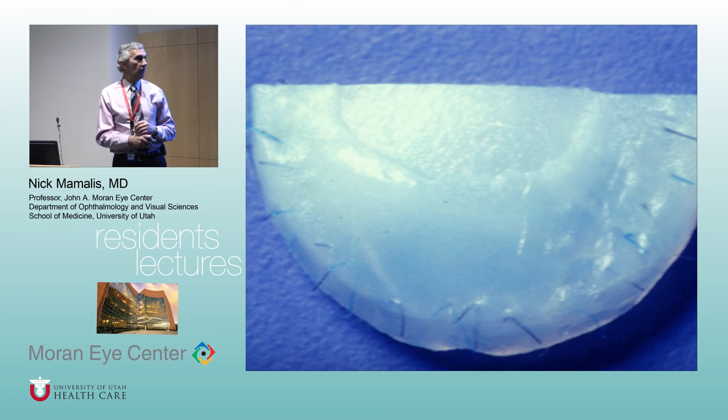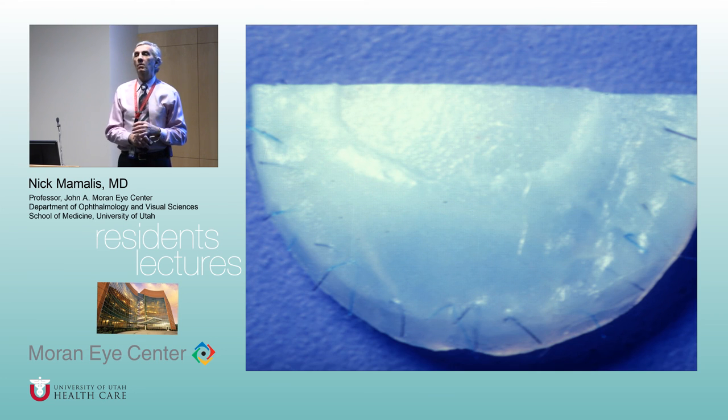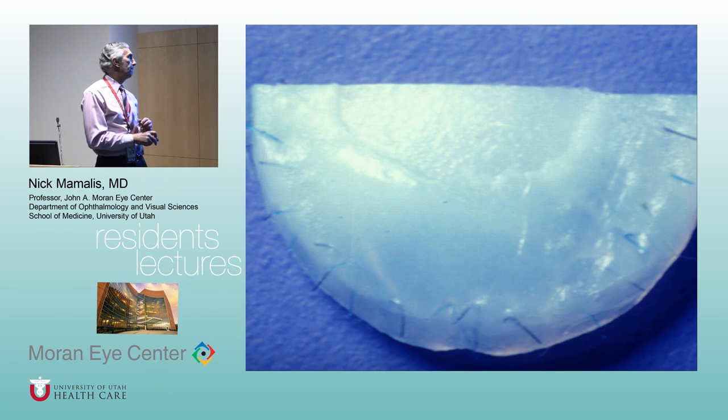Okay, so I'm sure this is a corneal button. It's been cut in half. What kind of surgery has this cornea had before? Yeah, you see the stitches that are there. And obviously this is a resident case because they're all irregular. They're not regular there. So this is maybe the cornea fellow's first case. Now, what do you make of that cornea? Yeah, it's thick, it's white, it's edematous.